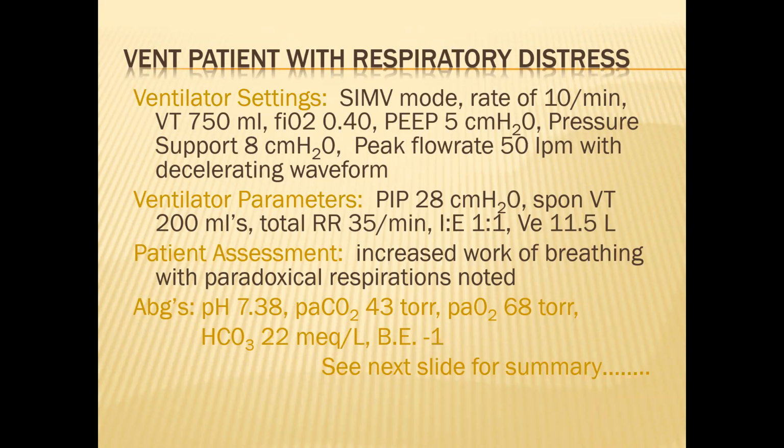Okay. I was going to say maybe adjusting the I:E ratio at all. So you would change the I time? Well, I'm just asking another additional thing, because usually I:E ratios aren't 1 to 1. But the person's breathing 35 times a minute, so you'd have to have a really, really short I time to not have a 1-to-1.